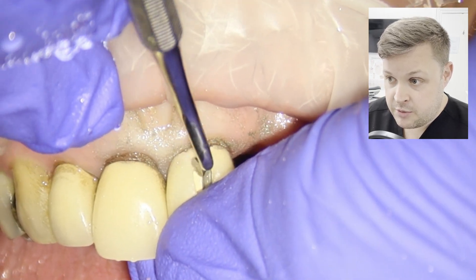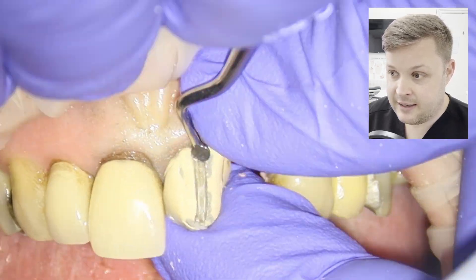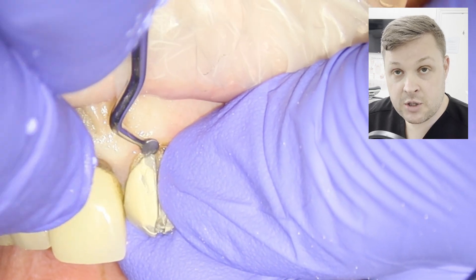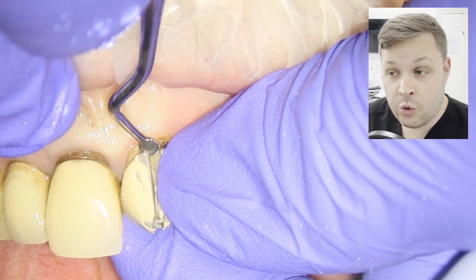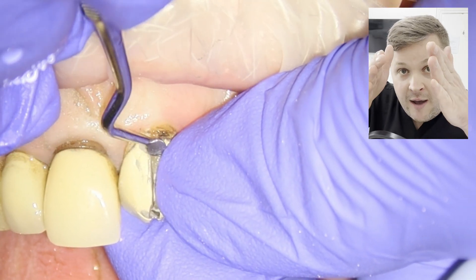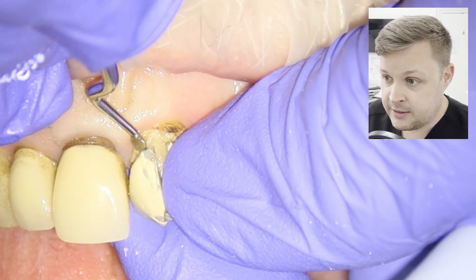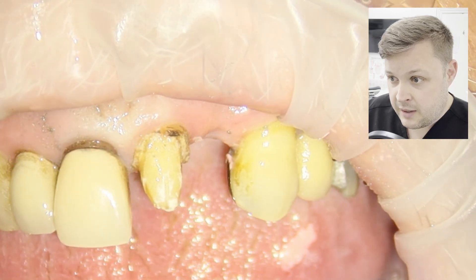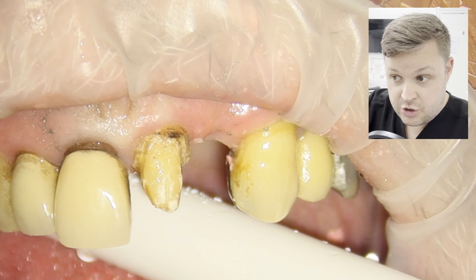What we're going to do now is remove the old crown and try not to destroy the underlying tooth tissue underneath. I'm cutting a channel down the middle of the old crown and then levering those pieces apart, and as you can see, it just comes away nicely. The prep tooth itself doesn't look too great.